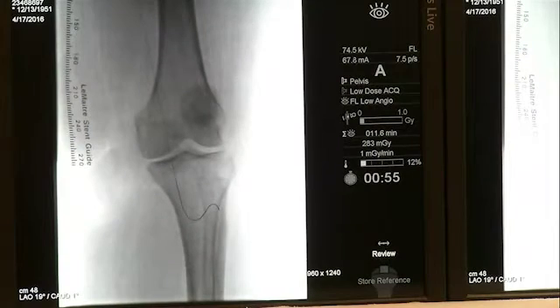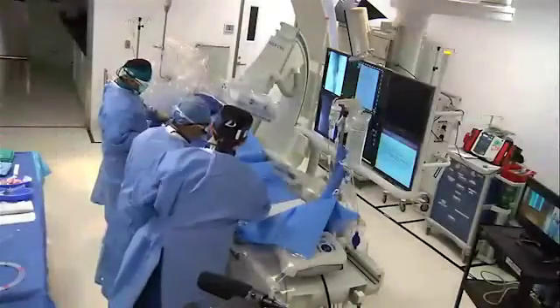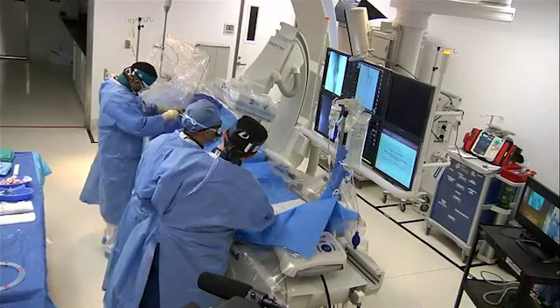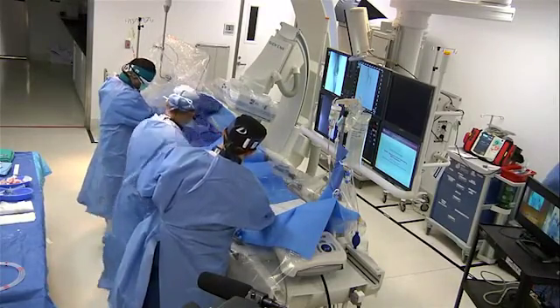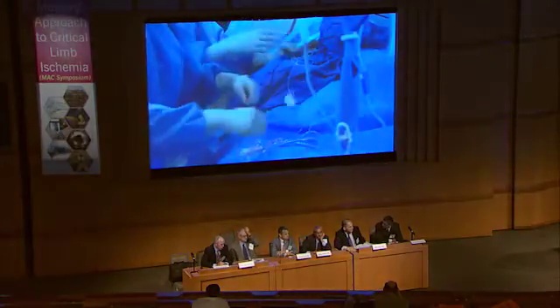No, I agree with you. That's why I showed that below the knee picture when you were discussing it. I think that the likelihood of finding too many fistulas below the knee is low. What I'm going to do at this point, we all agree, is put a couple of Viabahn. And the question is where to start the Viabahn? Where should we start laying the Viabahn? So let me ask the panel. Alec, you have a comment, and Dr. Manzi, regarding the location of stenting, or do you have other imaging suggestions?